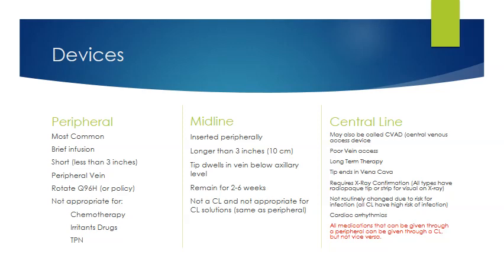We don't routinely change out central lines like we do peripheral lines, and that's in order to reduce infection. It could actually pose a greater risk than if we actually left it in place if we were to change out central lines. Okay, and also something that you need to watch for with all central lines, and we're going to talk about 4 different ones today.